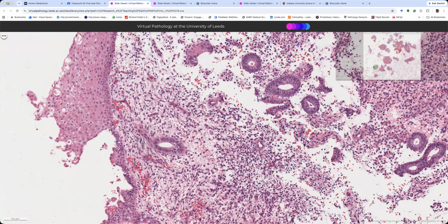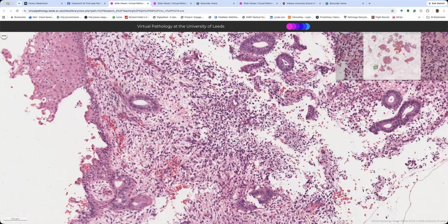Okay, it's not cervix, it's squamous on the top. It's not the ball-like morular metaplasia that you get in the middle of glands. True squamous metaplasia due to a long-standing IUD, streamy looking endometrial stroma, plasma cells visible at 10 times. Good.